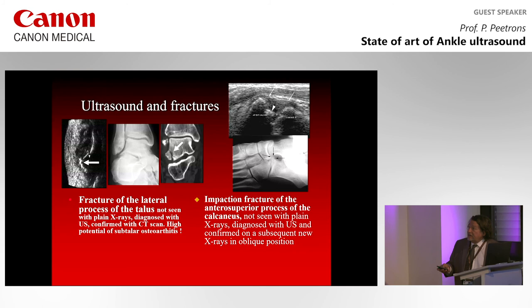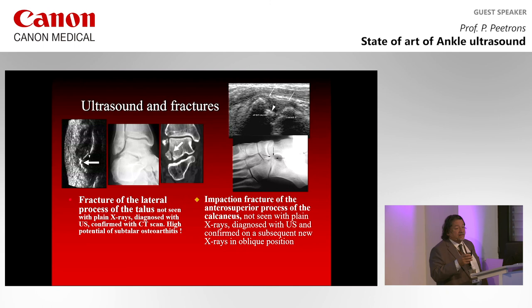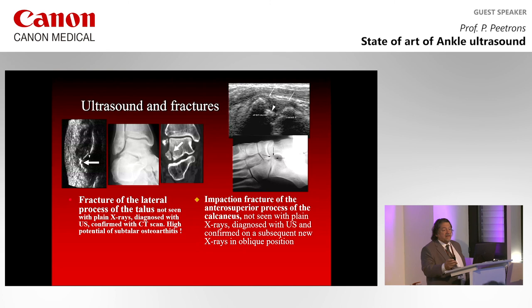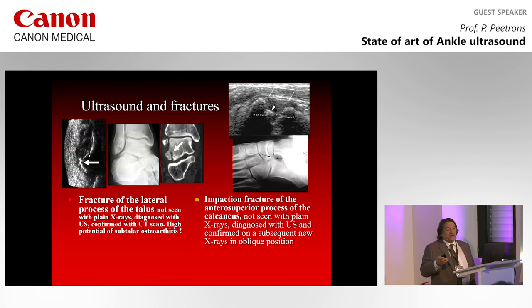Very important: the radiologist, who is in front of his patient, must always ask the patient, where do you feel the pain? This is our major advantage over the radiologist dealing with MRI or CT, who is not in front of the patient. After an examination where I see nothing in ultrasound, I always ask the patient, did I touch the place where you have pain? And then sometimes he says, sorry, but you didn't touch the place. Where is the place? There. And I put my probe there, and I see the fracture of the lateral part of the talus, for example.